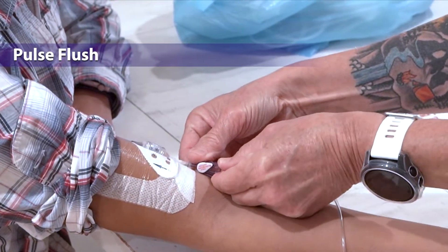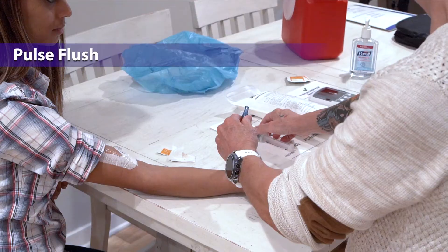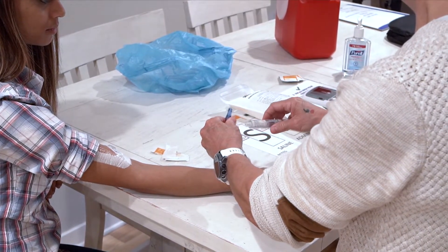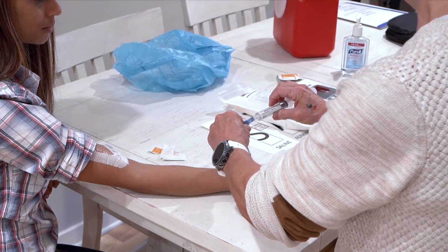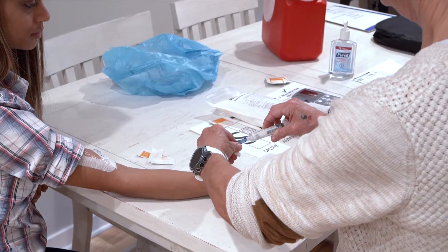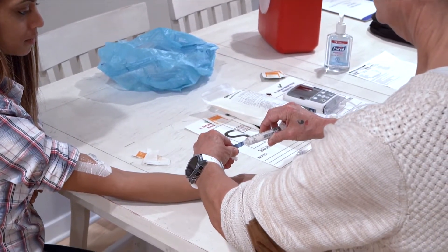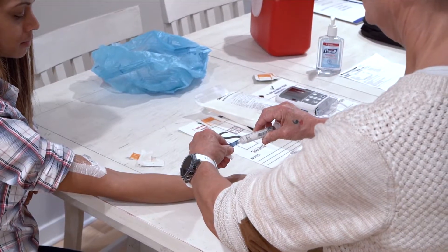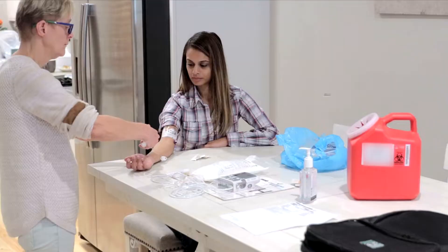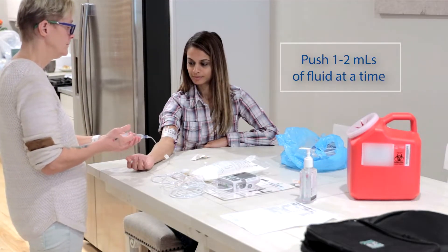Now you will pulse flush. Make sure any clamps are unclamped before flushing. Pick up your saline syringe and remove the cap. Do not touch the end cap that you've just cleaned. If you do touch or drop the end cap, scrub the hub again for 15 seconds with a new alcohol pad. Attach the saline syringe to the center of the hub and push and turn clockwise until attached. Now push 1–2 ml of fluid at a time until the syringe is empty.